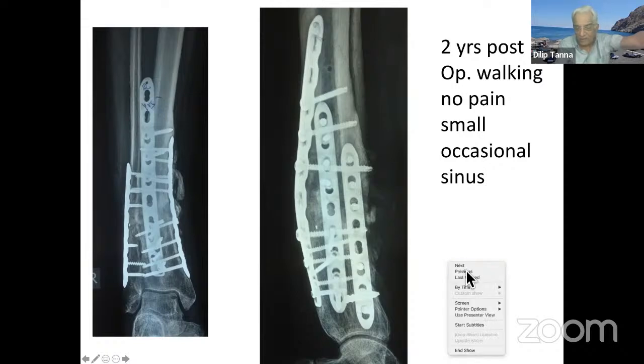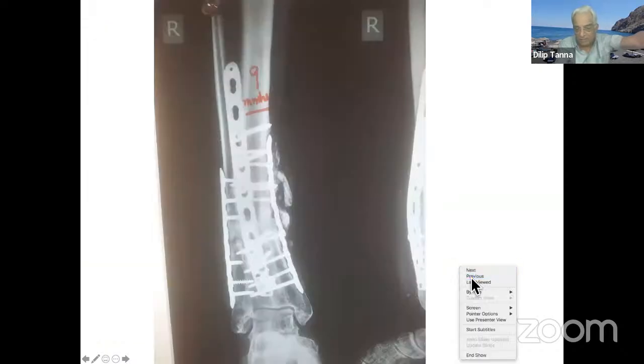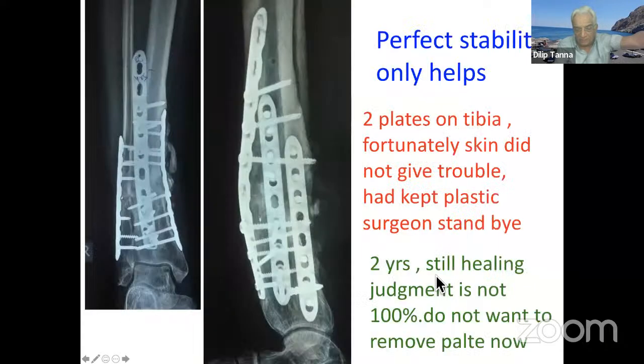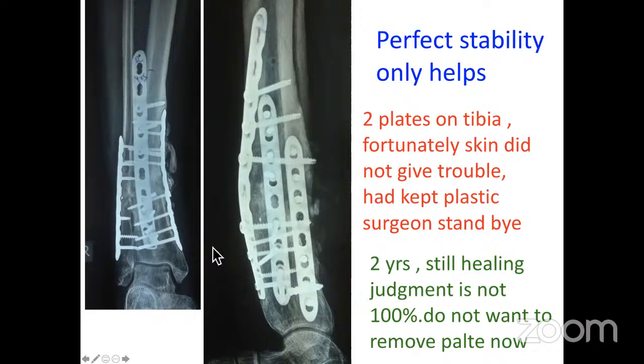So I felt even after a long time, you can still get the healing done, but the aggressiveness required is quite a lot. This part of it, though not seen in the vision, is seen in the X-ray, which I couldn't correct. Any comments? Sir, why not use a nail in this case?